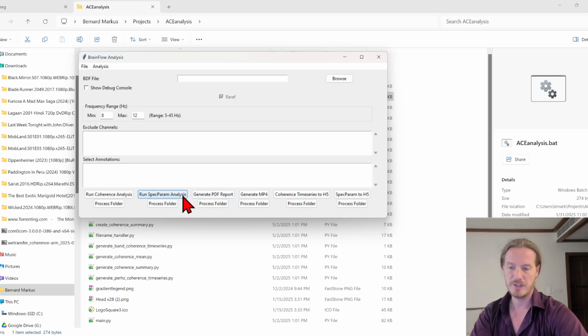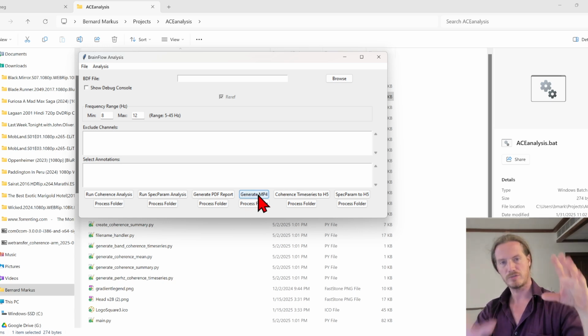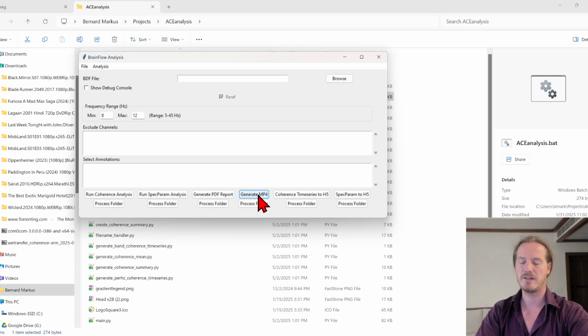It can generate a PDF report out of that. It can generate an MP4, like a video of the circle that moves, and now it shows the statistics on that, and all of that will be on the screen. And now it gets interesting.